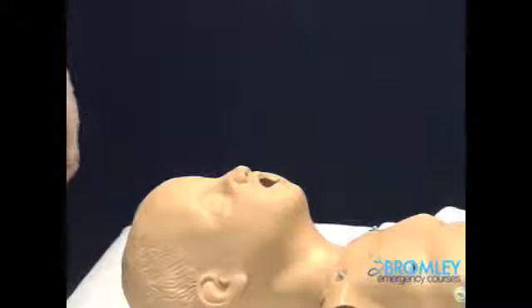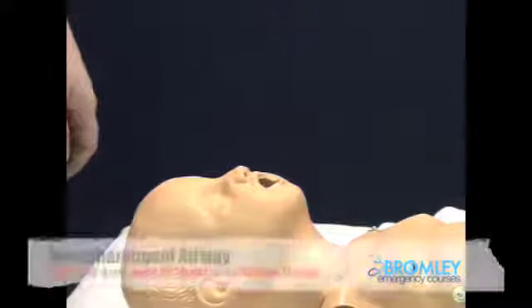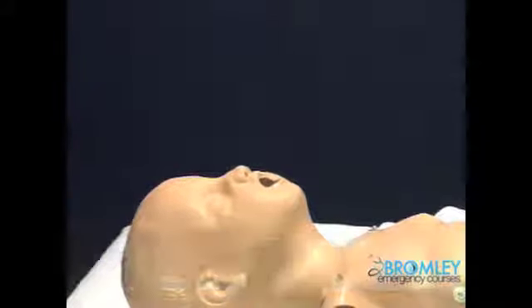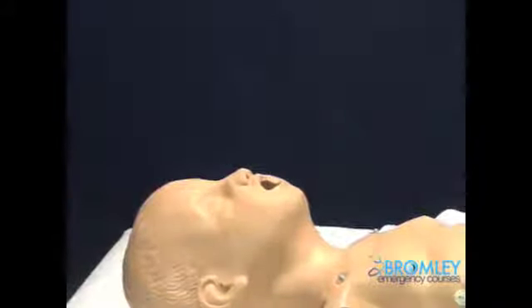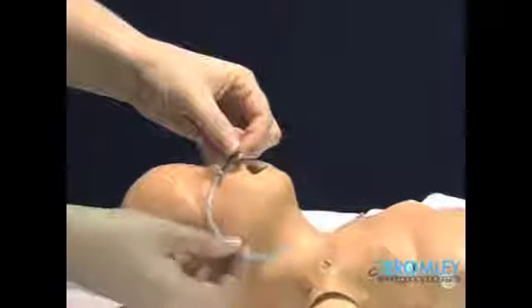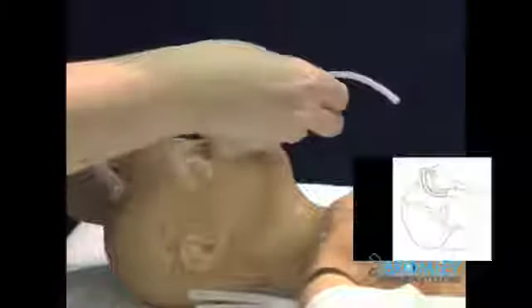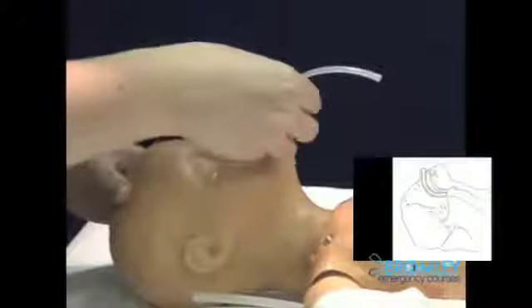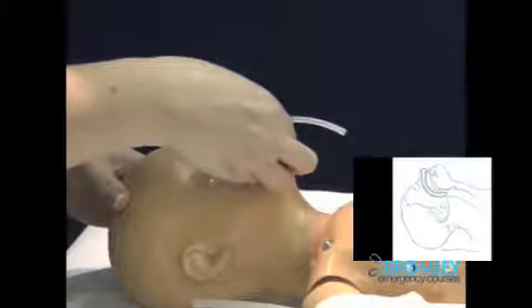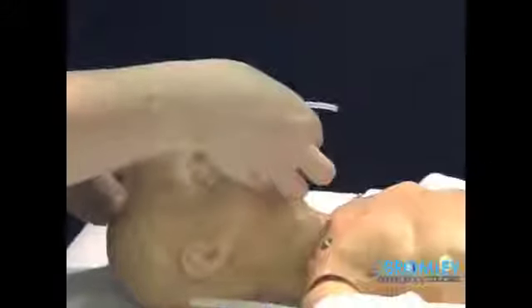Another alternative for an adjunct for the paediatric airway is a nasopharyngeal tube. These can either be formal nasopharyngeal tubes or cut ET tubes. It's sized from measuring from the nostril to the tragus and inserted through either of the nostrils, aiming directly backwards.